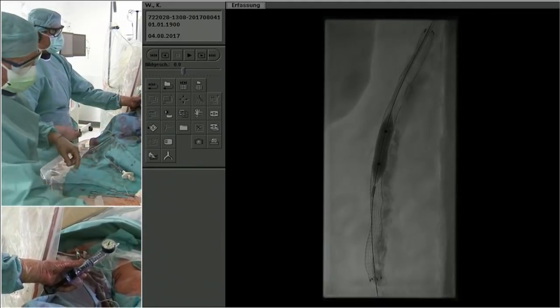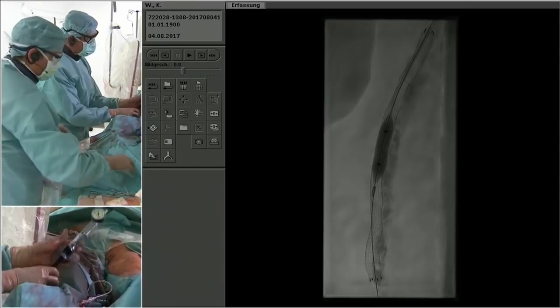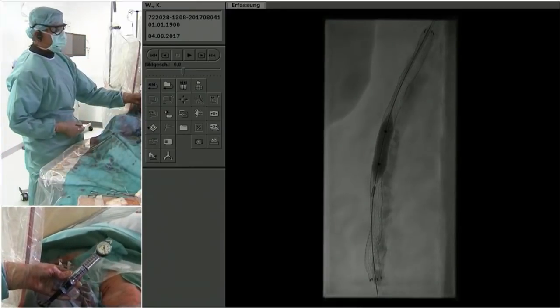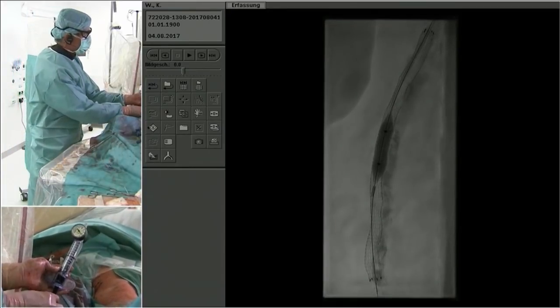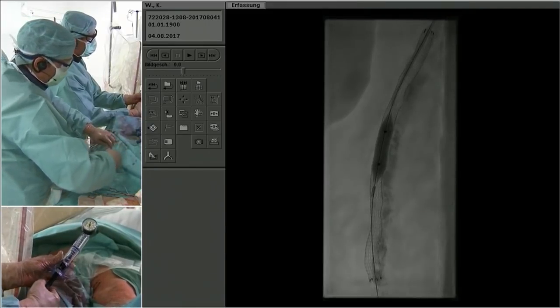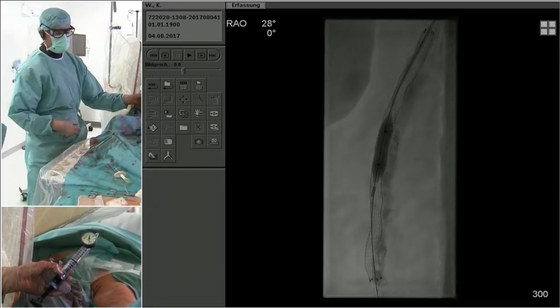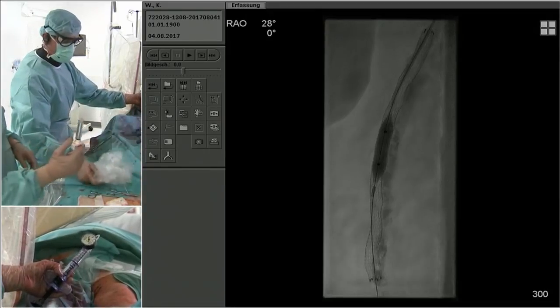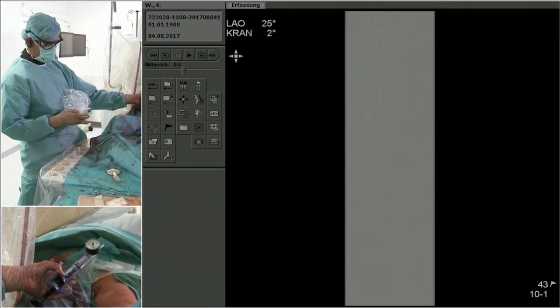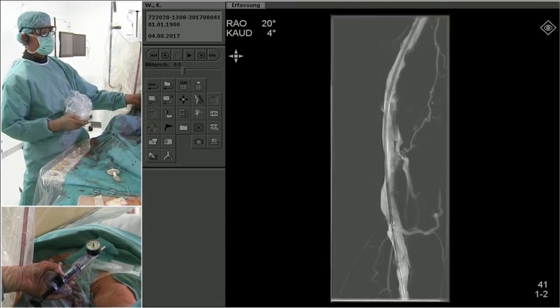And this is 7 millimeter? For a while. 720. It's 720, exactly. Mehdi, you missed a good question. Are you happy with this result that Andrej is going to show, and not use a Supera inside the Viabahn? The second question to you is, do you think if there is recoil of the Viabahn, will Supera actually prevent it, or will you only use some spot Superas? So these are the three questions we discussed while you were away.